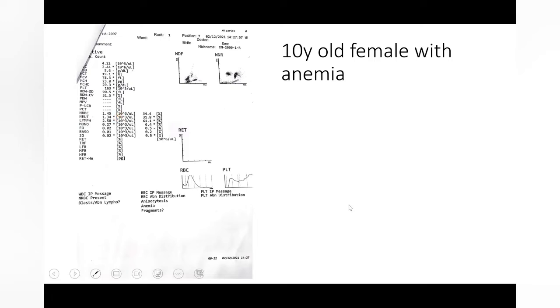So now what will you do? This is a 10-year-old female. She is having nucleated RBCs. So what are you going to do now? So you know nucleated RBCs are coming.